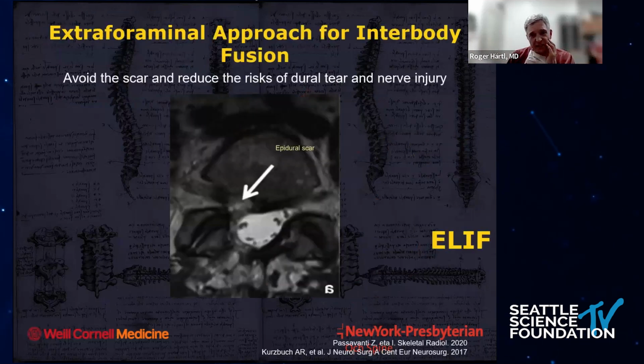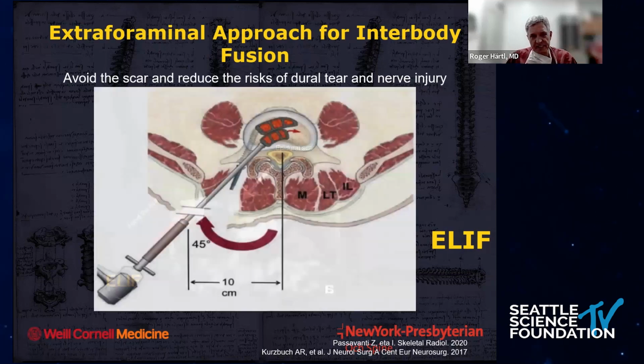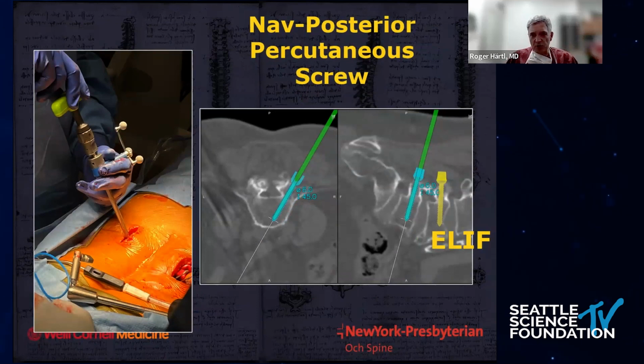In this particular case, this patient had a decompression. We had to go back to a fusion. So instead of doing a TLIF here, we went extraforaminal. So we did an extraforaminal approach, lateral to the facet joint, minimally invasive, of course. And that has been described. There are not many larger series, but it is a really nice approach that I've been utilizing more and more recently. And I do everything with navigation.